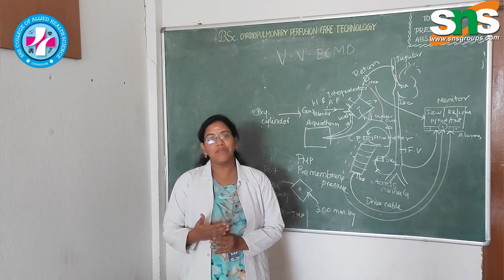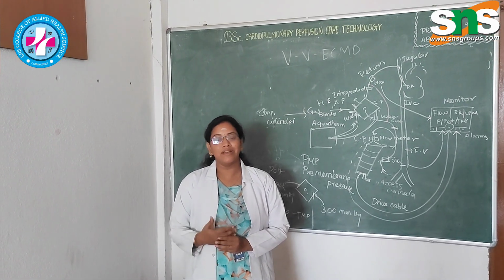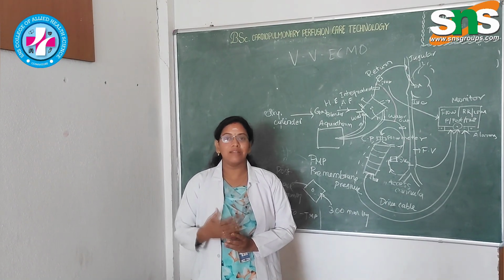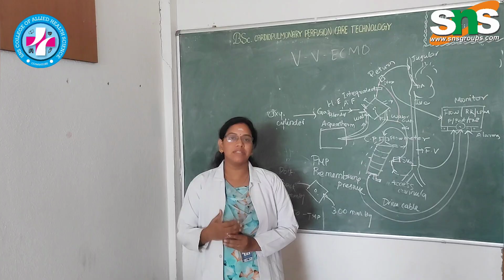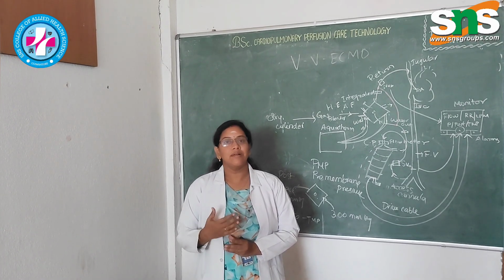In spite of giving more oxygen through ventilatory support, he could not cope with the oxygen support. So the patient was enrolled for VV ECMO, where the patient was given that support for almost 14 days on ECMO. After 14 days of ECMO and the recovery phase, the patient was discharged on day 47 with clear lungs after the VV ECMO.